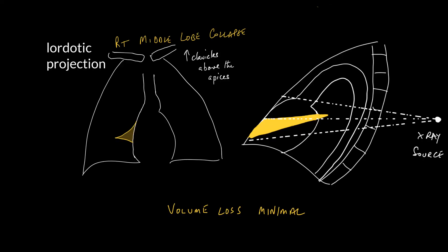The reason for this is that in the lordotic projection, the clavicles are projected above the apices, and at some point the x-ray beam is tangential to the interface, and then you tend to see it on the PA chest x-ray. Middle lobe collapse is often produced by inflammatory pathology or mucus plugging, and do note that volume loss is very minimal with middle lobe collapse, purely because the middle lobe does not carry that much volume.